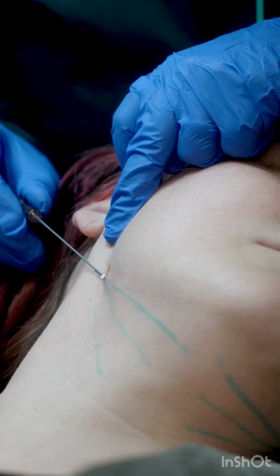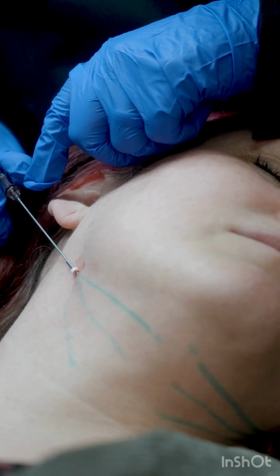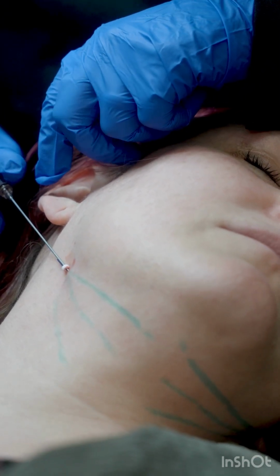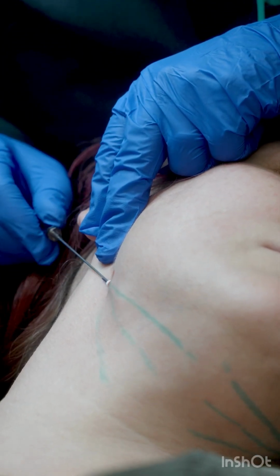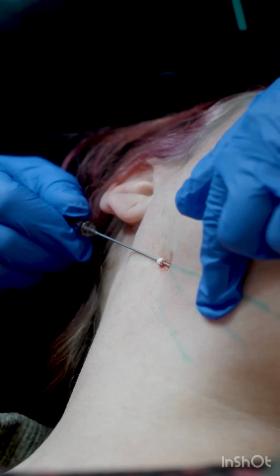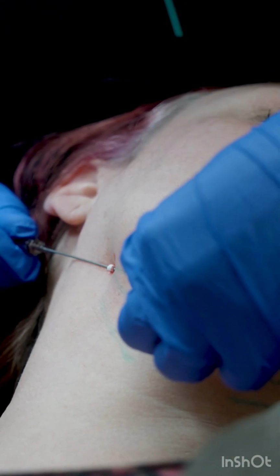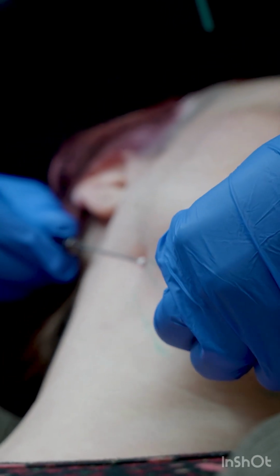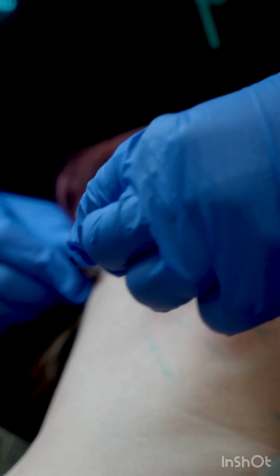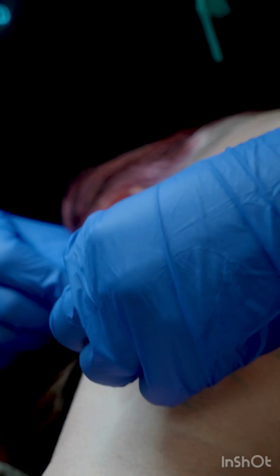Now I'm inserting the first PDO thread into the area, and I'm going to follow the track that I've demarcated with the marker prior to starting. By carefully inserting the thread in a curtain rod-like fashion into the tissues, I'm able to embed the thread in the correct plane to ensure that the treatment is successful and she achieves maximum benefit.